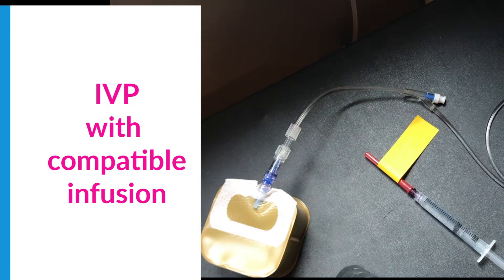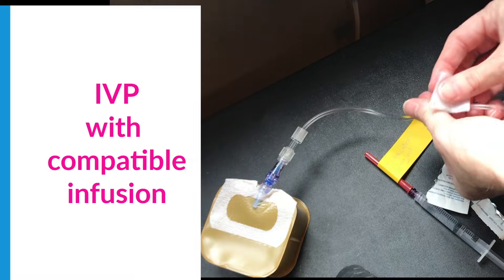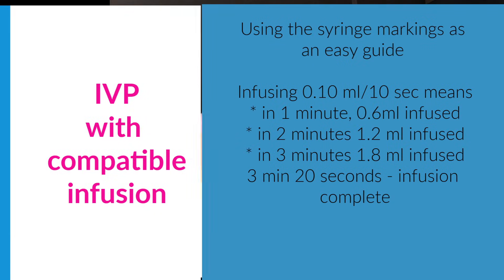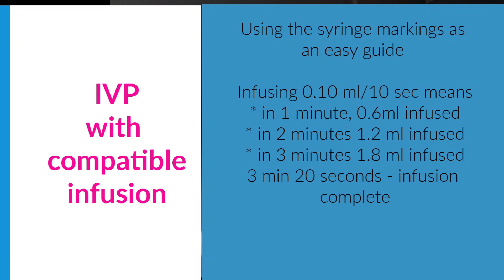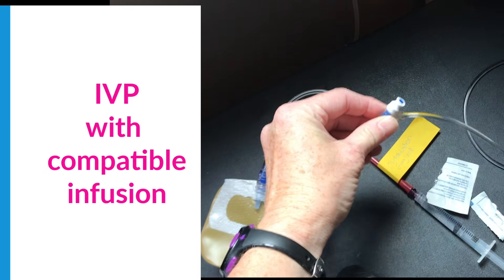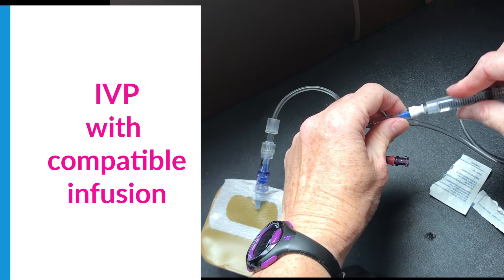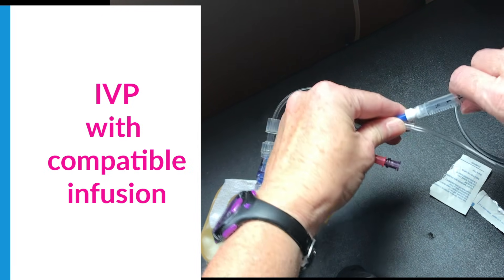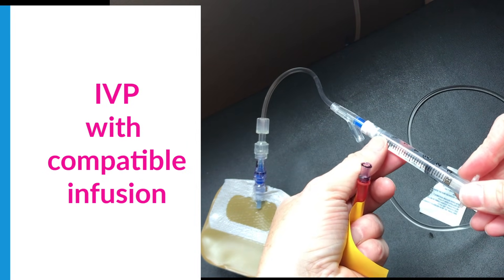With the saline infusion running, I'm simply going to clean off the port closest to my patient for at least 15 seconds. I don't have to stop the saline — I'm simply going to let that run. I'm now going to attach my ondansetron and turn it so that I can see all of the graduation lines.